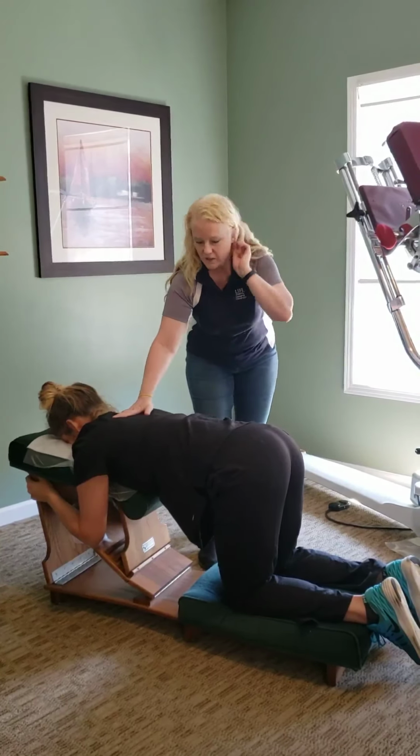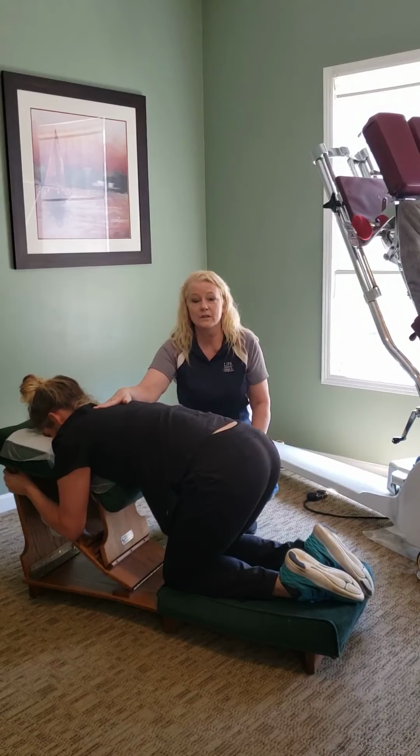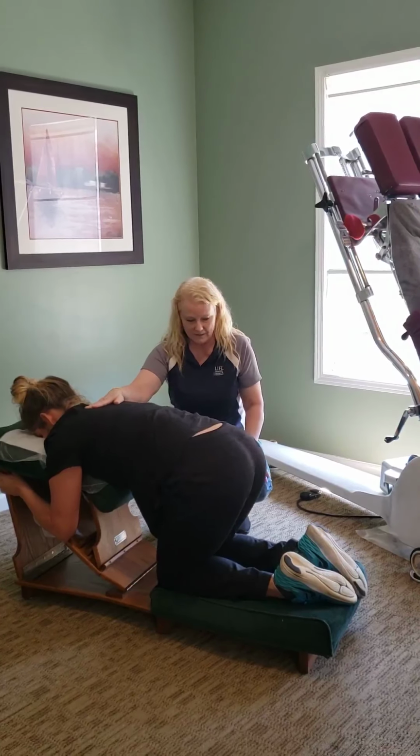of the time patients will come in and they'll have their knees really, really close to the headpiece. So go ahead and put your knees together and bring them really close. So they'll get on the table like this, so you have to correct that. So one of the things you want to be careful of is how you talk to your patient. So I need you to walk your knees back, please.